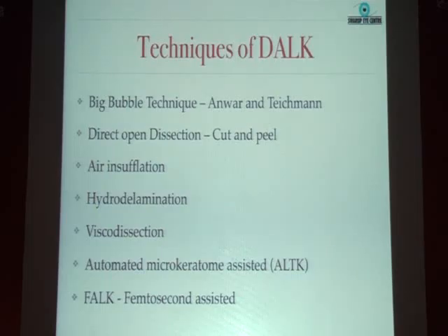Air insufflation involves injection of air basically to separate the stroma from the Dua's layer of the Descemet membrane. Hydrodelamination, you are basically opacifying the stroma. Air insufflation is not that, that's the bubble. In air insufflation, you are opacifying the stroma with air. You are creating an emphysema, and that way you are able to see the stroma all the way to its depth. And the same thing when you put fluid, that's called hydrodelamination.